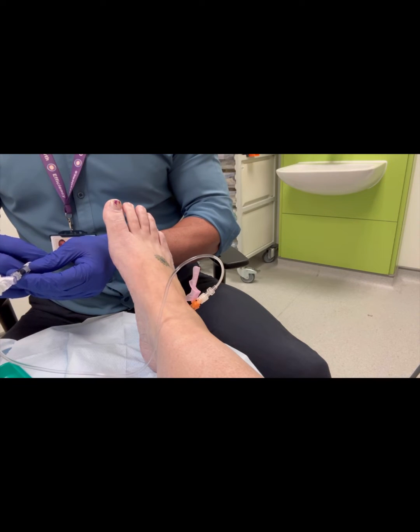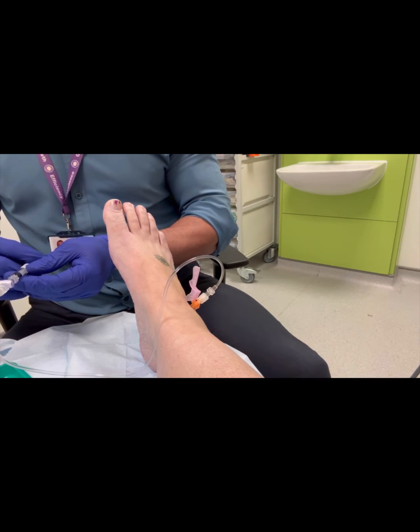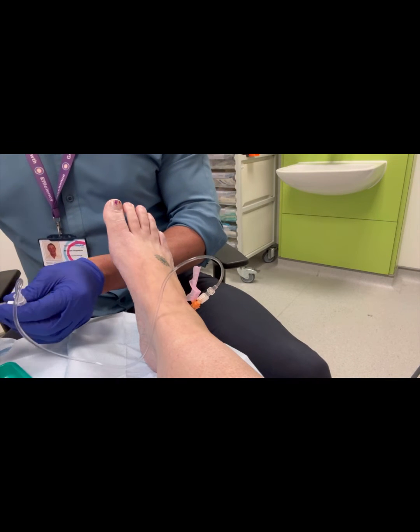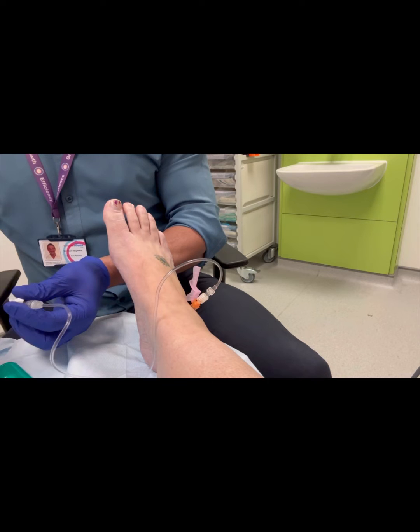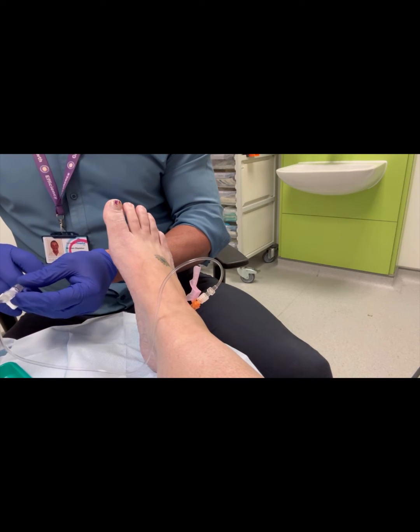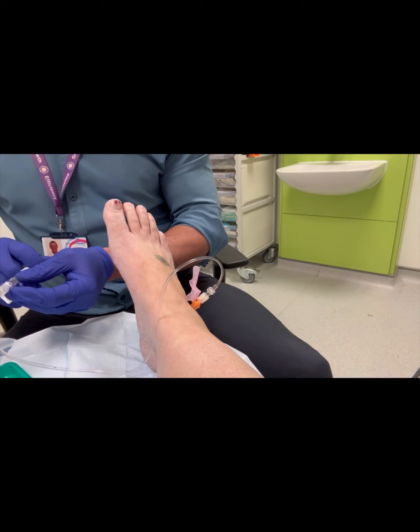I utilise a connecting tube, as you can see here. This enables me to perform what is a rather high volume injection without utilising large syringes, which can be ungainly and difficult and uncomfortable for the patient.